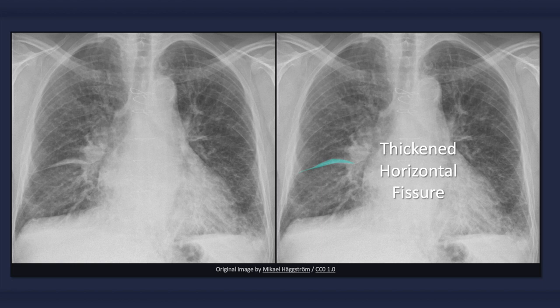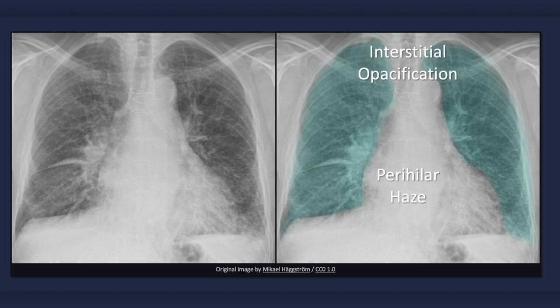Also evident in this image is a thickened minor, that is horizontal, fissure. This finding is easier to detect on a lateral radiograph, where both the oblique and horizontal fissures may be visible. Collectively, interstitial edema results in widespread blurring of lung markings, with the loss of definition resulting in a hazy appearance of the lung fields and hilum bilaterally.